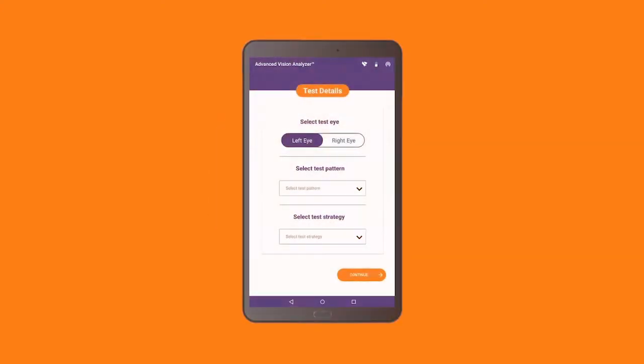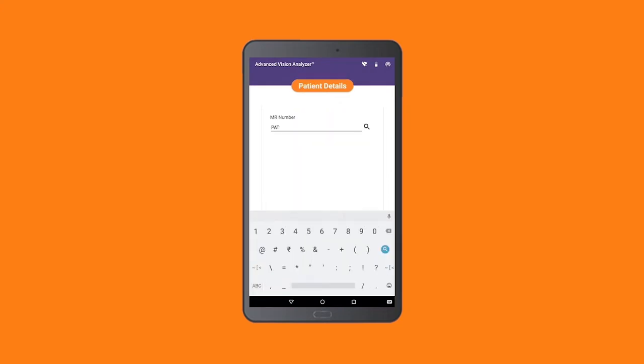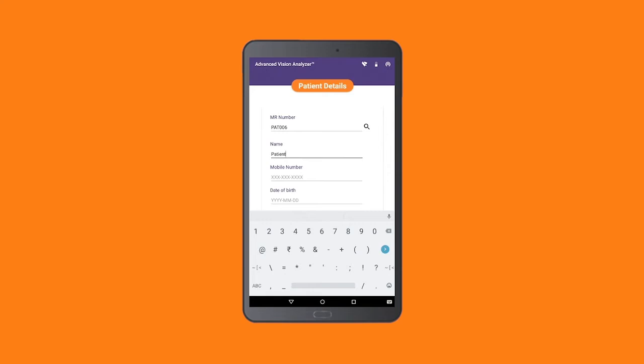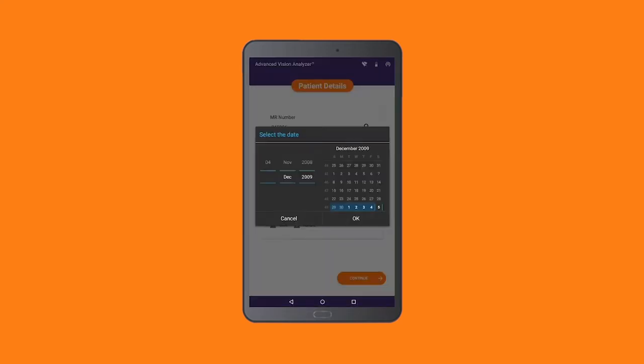Once the screen in the HMD turns green, select New Test on the tablet to begin the process. Select the testing eye, the type of test pattern to be performed, and the test strategy you would like to use. To set up the patient's information, enter the medical records number and click Search. If the test has been performed previously, the existing patient details will be displayed. If the patient is undergoing the test on AVA for the first time, you will need to enter their information into the system.